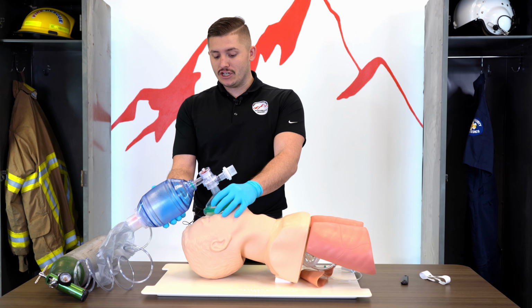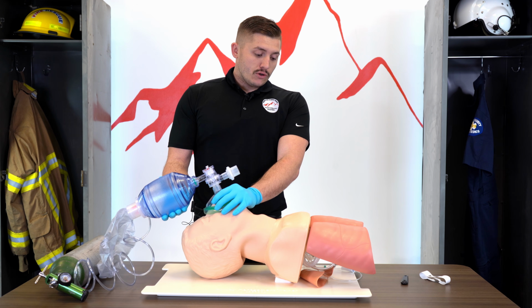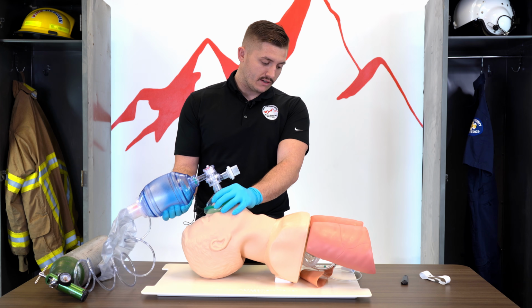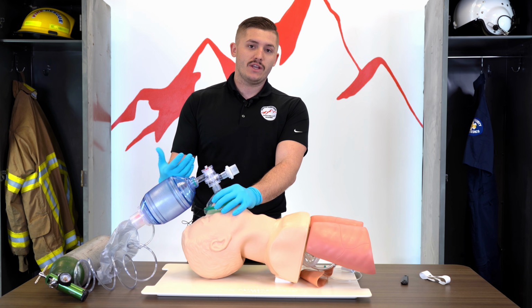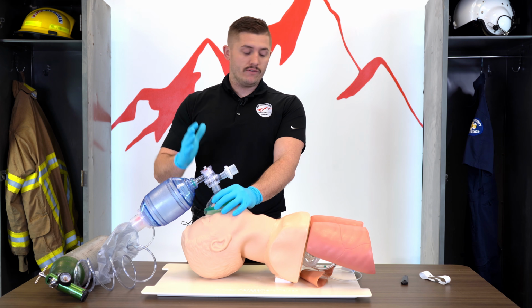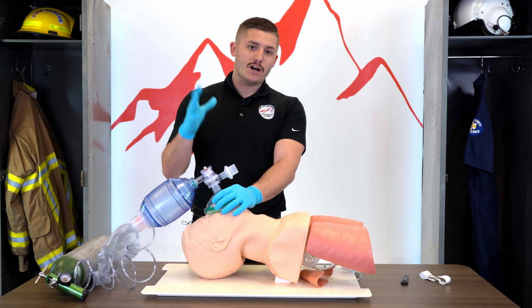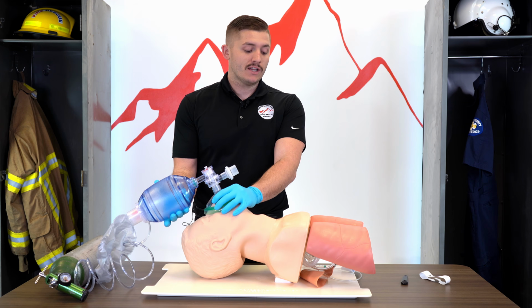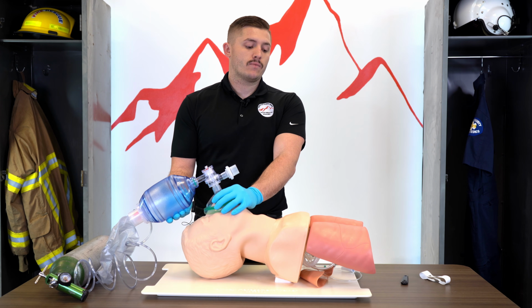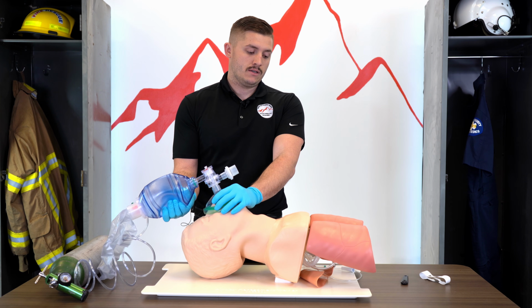One thing that's very easy to do and something we see a lot, especially in the field and in testing, is students or newer EMTs will go 1,000, 2, 1,000, 3, 1,000, 4, 1,000, and they're not actually counting, they're over ventilating the patient. So I know you're nervous, I'm nervous, the patient's family's nervous, but you've got to be that calming effect on the call. Take a deep breath. 1, 1,000, 2, 1,000, 3, 1,000, 4, 1,000, 5, 1,000, 6.